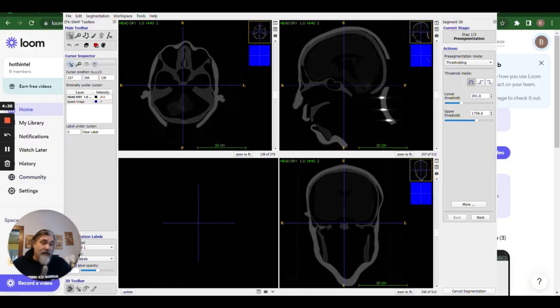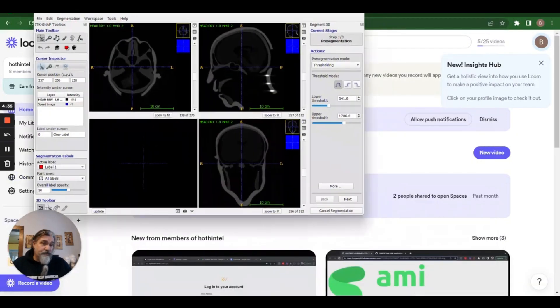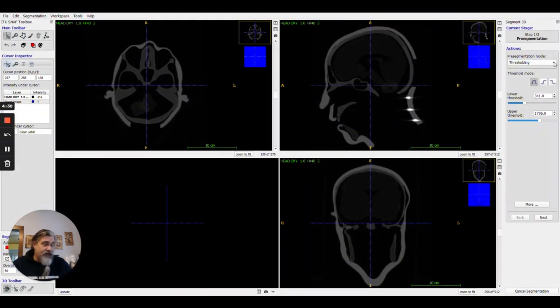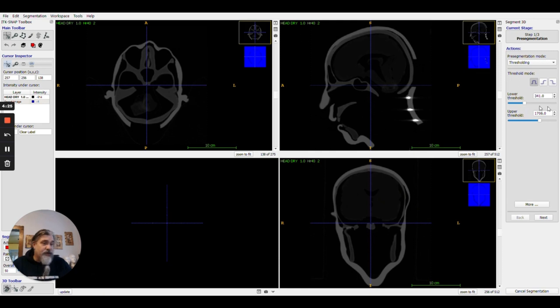You've got a few options. For our purposes I'm just going to use the thresholding tool right at the top and I can use these slide bars to adjust the properties.